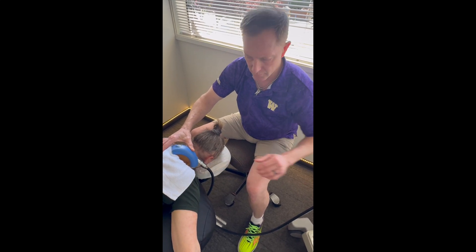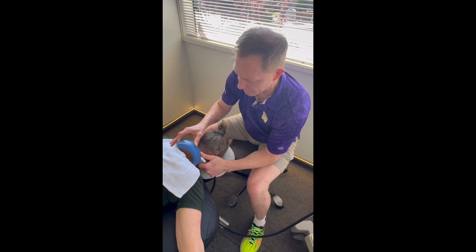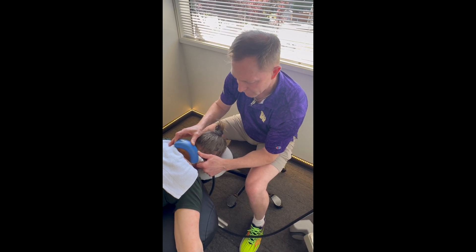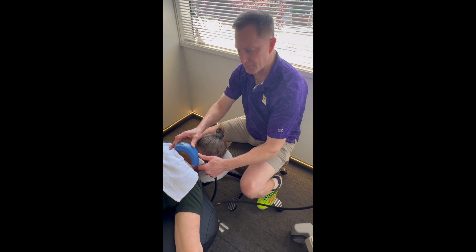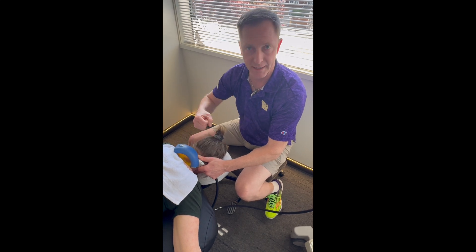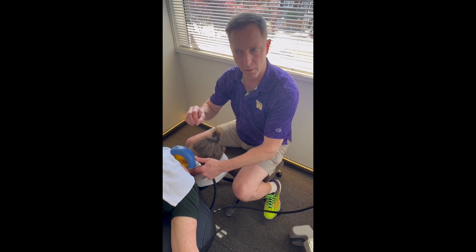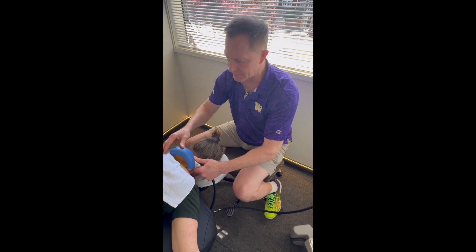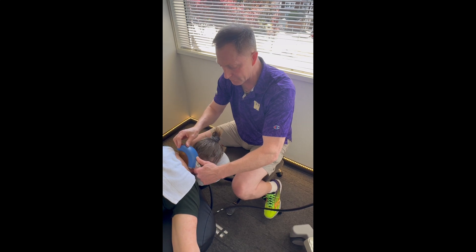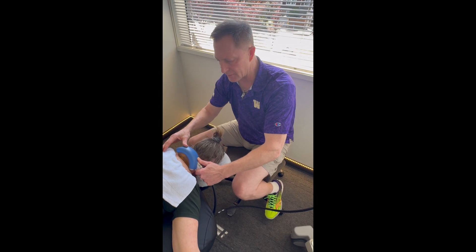I'm going to give her a couple more. You can hear the machine changes its timbre a little bit. She says relief right on the bone. And this is really what this piezo wave is all about — I'm not having to do a lot of work. There's no damage to her skin, no pressing red marks. Yet we're getting this energy down at the bone where we want that change, in the nooks and crannies of the bone. The sound wave energy keeps building up and relaxes the tissue. That is the whole reason we brought this piezo wave in.